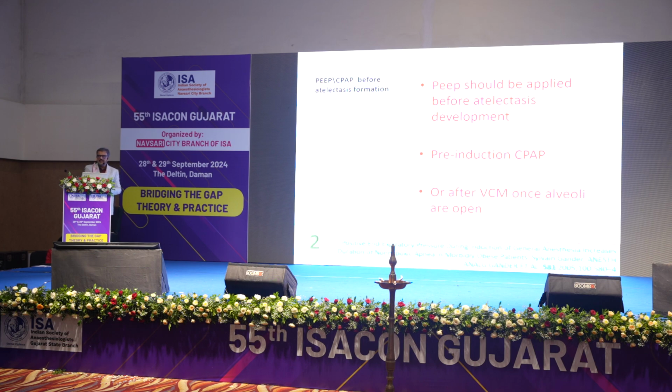So where to deliver PEEP? If you want to deliver PEEP, it prevents atelectasis formation. So PEEP should be delivered during pre-oxygenation. That prevents atelectasis formation. It should be continued throughout the procedure, and you should extubate the patient over CPAP. So CPAP from the pre-oxygenation, throughout the procedure, and at the time of extubation. Keeping the lung open throughout the surgery is called the open lung strategy.